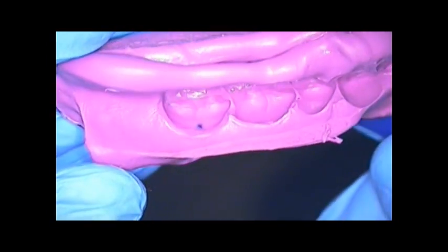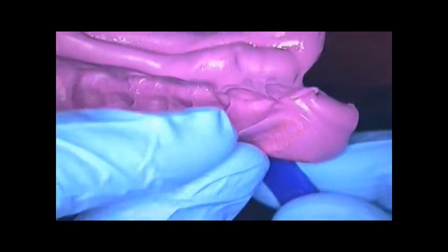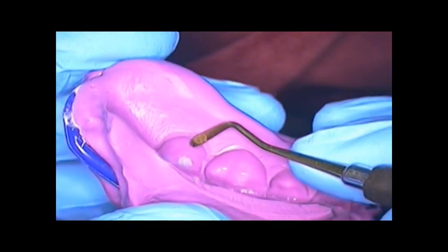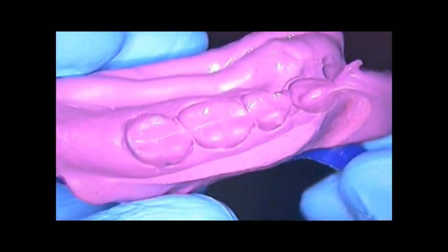I like the Reprosil impression material. I think it works really well for what we need in our routine crown and bridge. I've been using it for years. I'm sure there are other products out there that many dentists are using right now, and also in dental schools. But if it's not broken, don't fix it. So I still enjoy using it. Again, just being careful, attention to detail. Looks like we're coming up on our time.